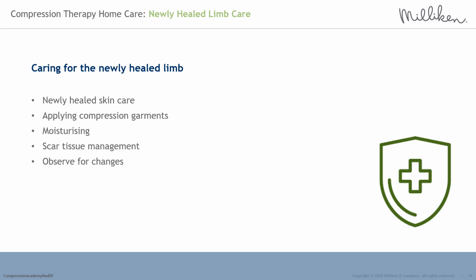Themselves, their relative or carer will be shown how to apply their compression stockings correctly. They may be issued with or able to purchase a device to assist with easy and safe application. It is important that the stocking is applied smoothly and does not cause any trauma to the newly healed area during application. We need to be aware of fingernail trauma on application.